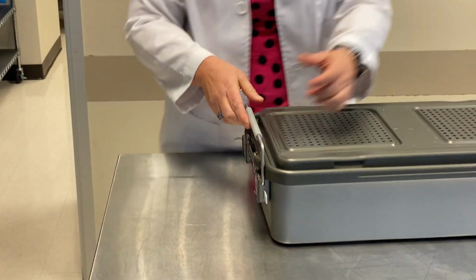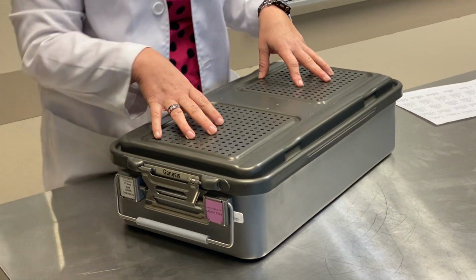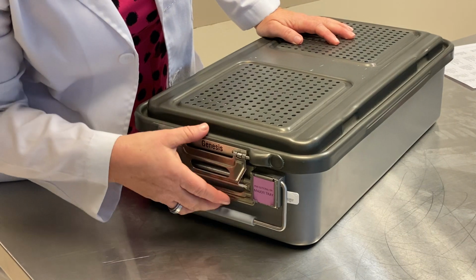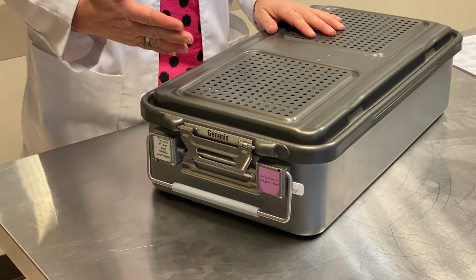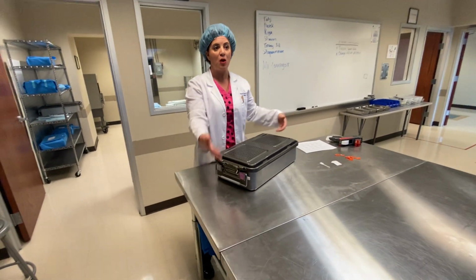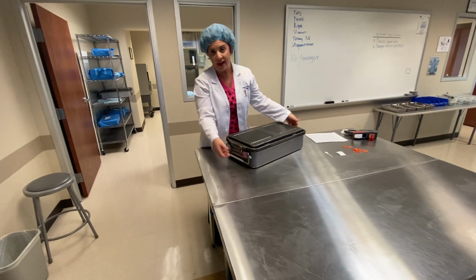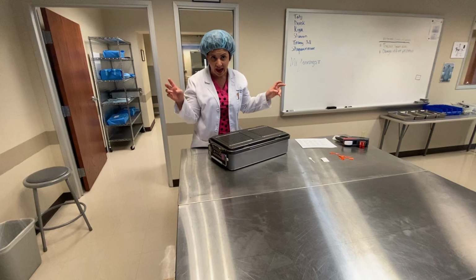So the thought is twofold. Once this has been exposed to the steam sterilization process, this will turn a dark brownish black. It will give you that visual cue that it's been sterilized. Also, it kind of gives you this tamper-proof mechanism, because if this is intact when you bring it into the OR, you know that its integrity is still good. However, when we get ready to open it in the OR and we pull these handles up, it's going to break this lock, damaging the integrity, right?